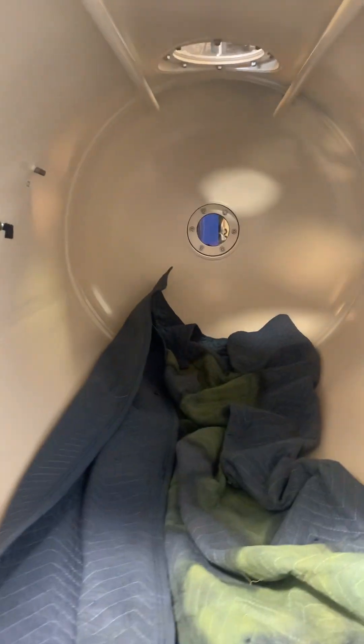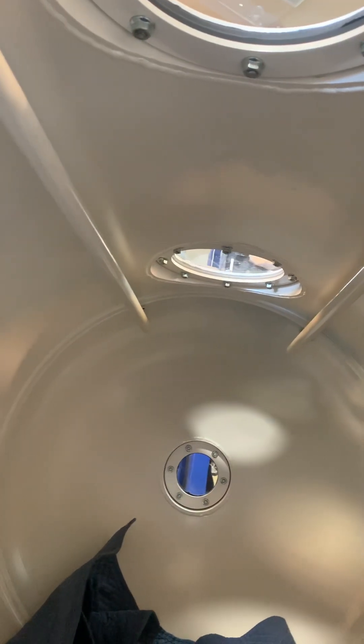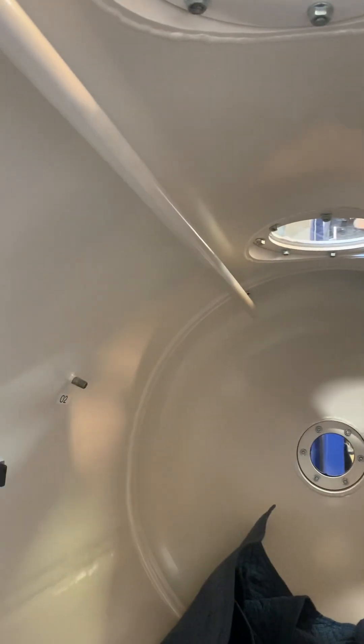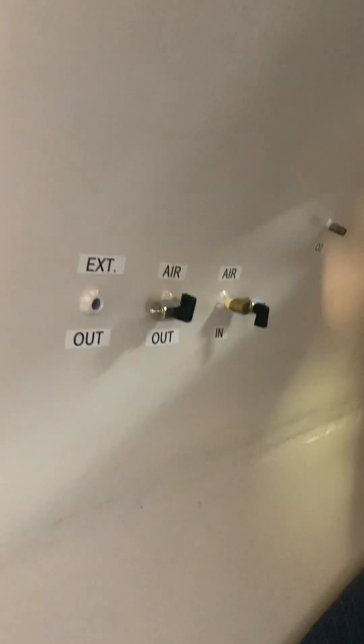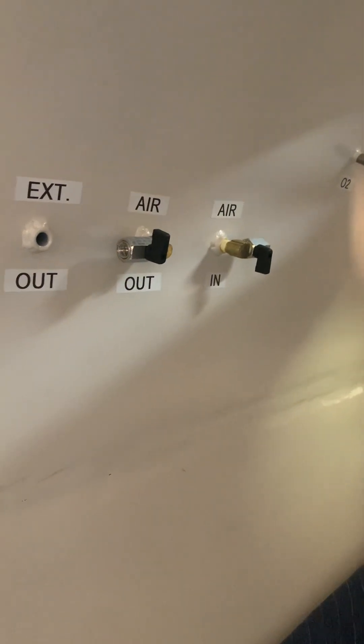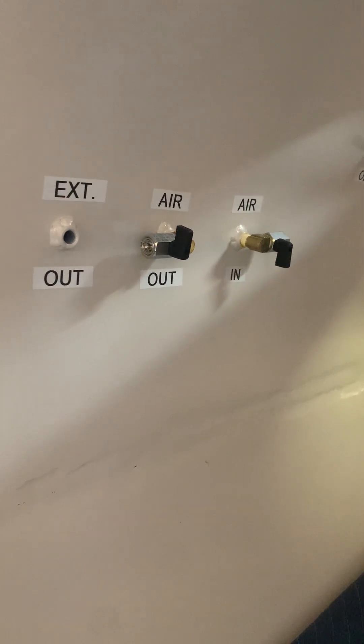Let me show you a little bit of the inside. There are two windows on the top. We've got the metal rings up on those with gaskets, and I used an RTV to seal it. You can see over here we've got our air out, air in, and exterior air out.